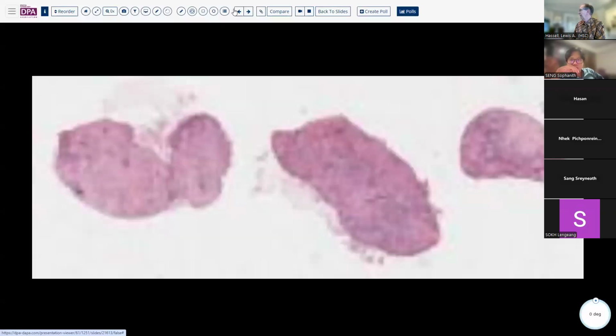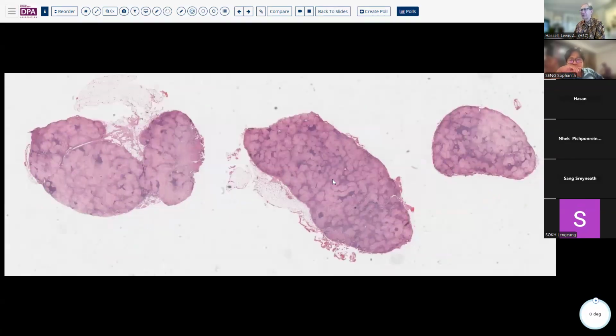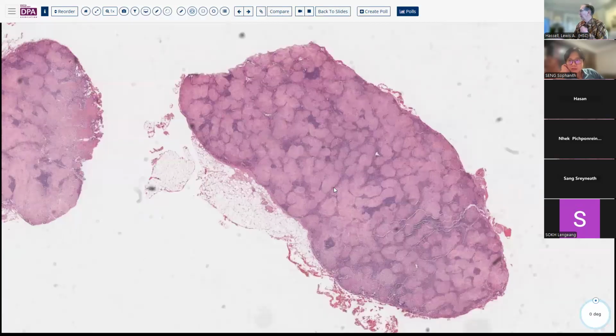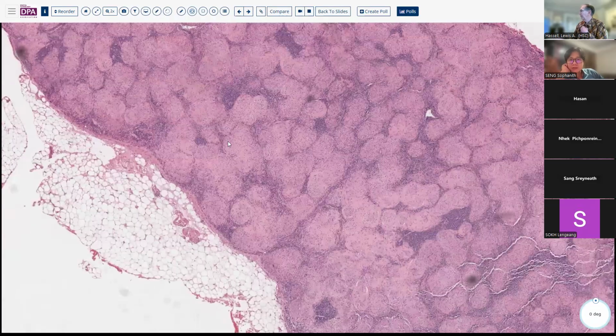Okay. Well, I mentioned that sarcoidosis was in the differential. I thought I should at least put a slide in here that was a good example of that. I know this is maybe not the most common disorder in the mediastinum, much more frequently encountered in the lung. But because mediastinal lymph nodes can often be involved and can raise concern for malignancy and so forth, they may be the ones that are biopsied. And so an awareness of what sarcoidosis looks like is, of course, important.